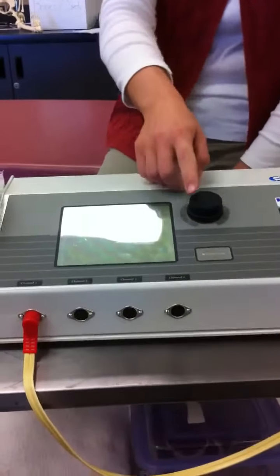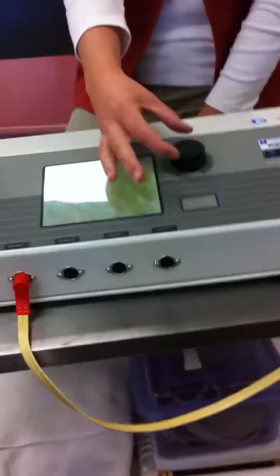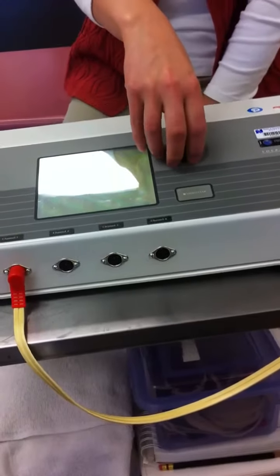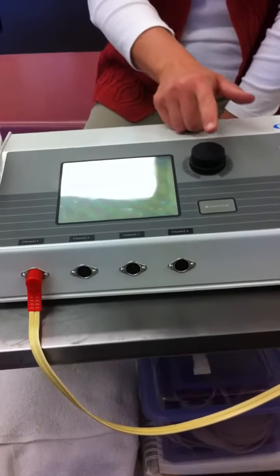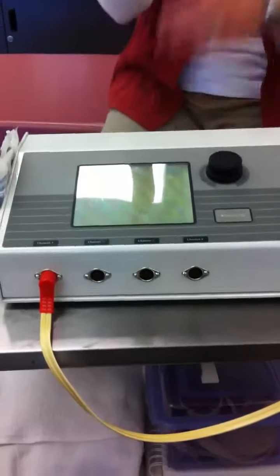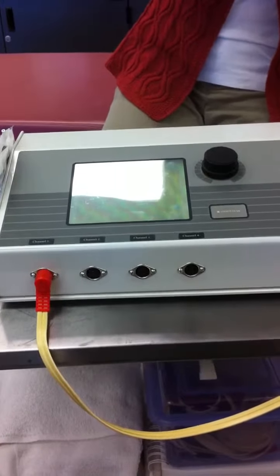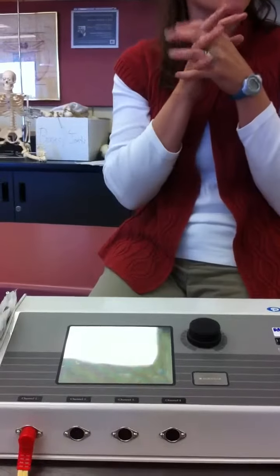That's it. Okay? So once you have your electrodes set up, what you're going to do is spin this dial. All right? And it's not a take your hands and slowly do this. It literally has to be a pretty quick spin of this dial. When that happens, you'll see down here that there's a little readout where a bar will start to slowly increase and darken and show you how many milliamps you have of current running.